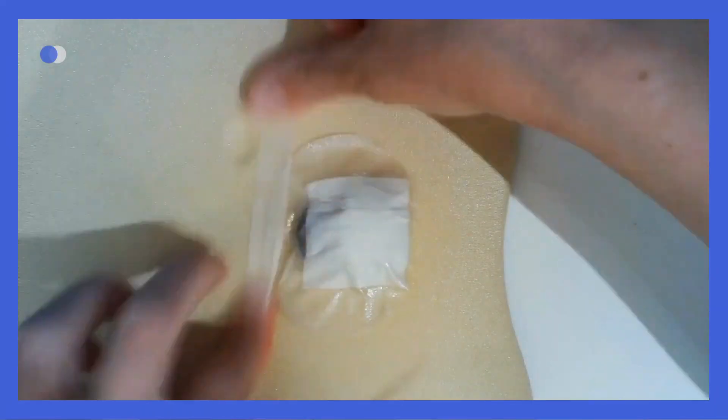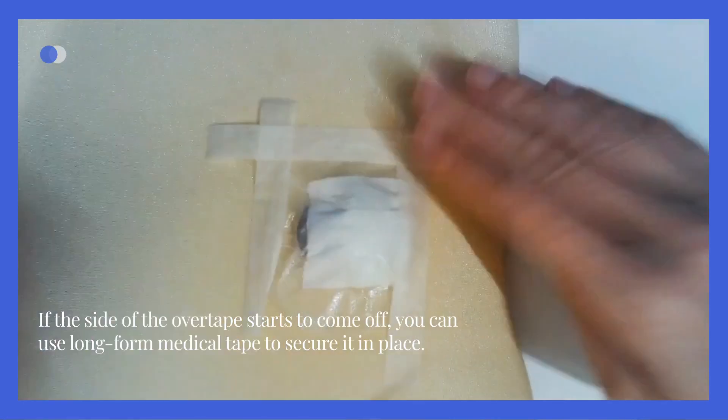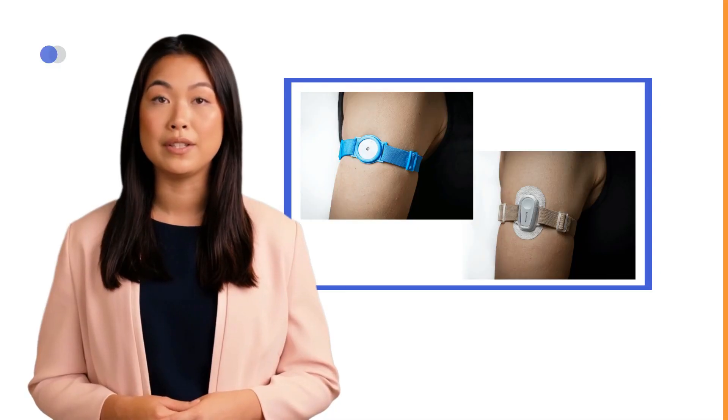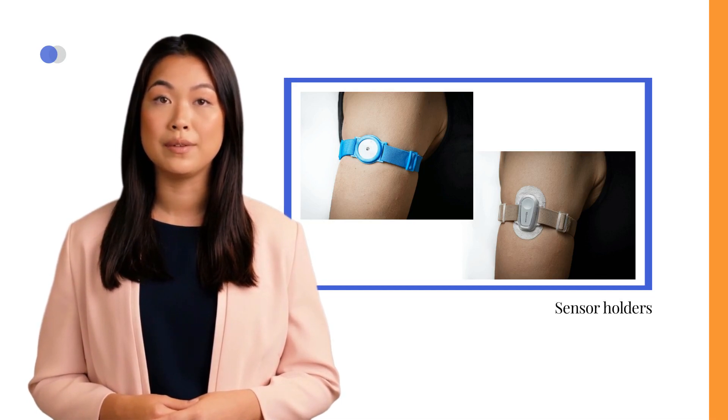If the side of the overtape starts to come off, you can use long-form medical tape to secure it in place. Additionally, there are sensor holders available that can effectively keep the sensor securely positioned during daily activities.